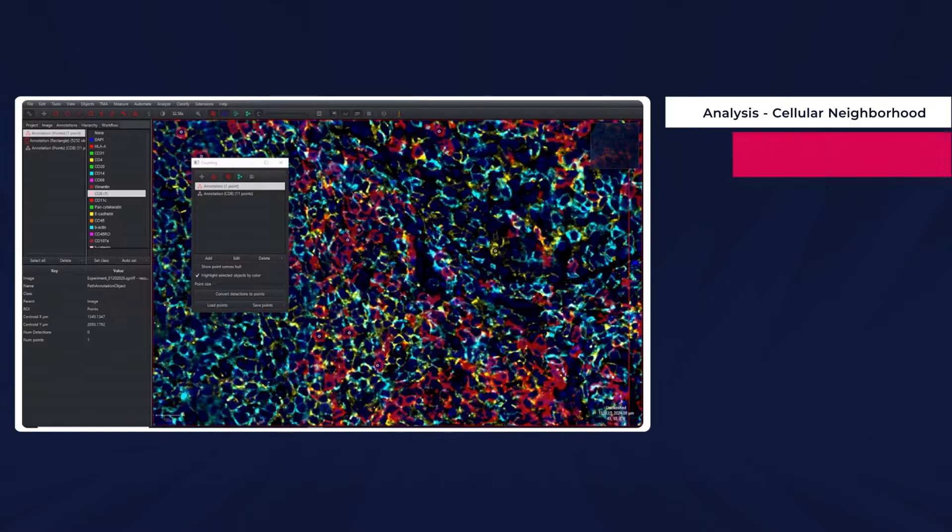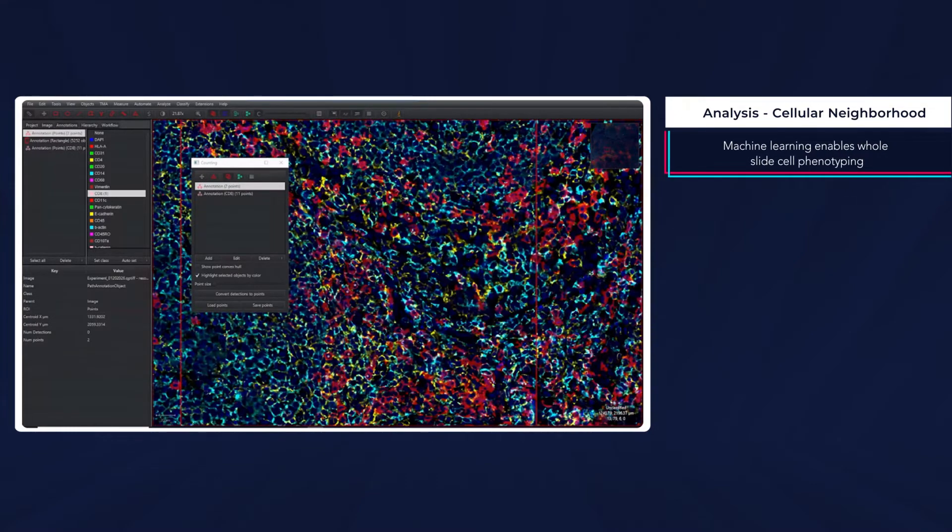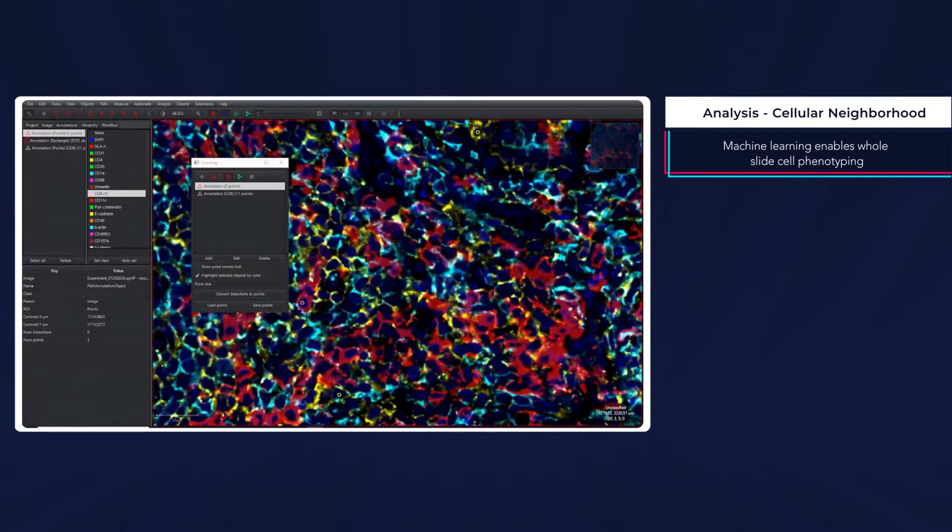Machine learning can be used to teach the computer how to recognize cell types of interest. This process is capable of whole-slide analysis and is user-friendly.